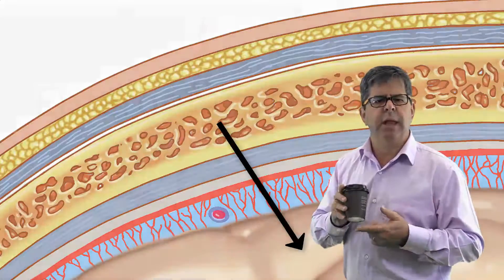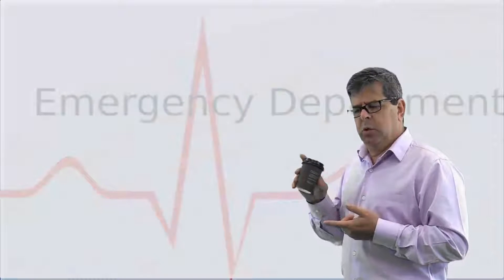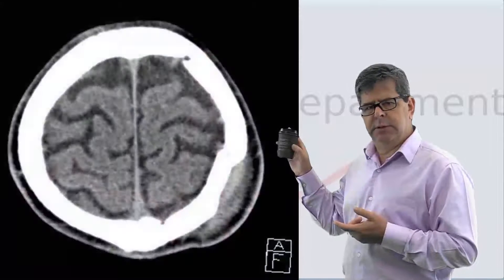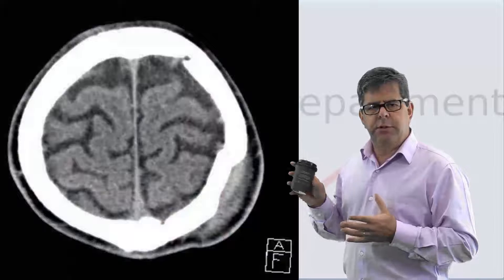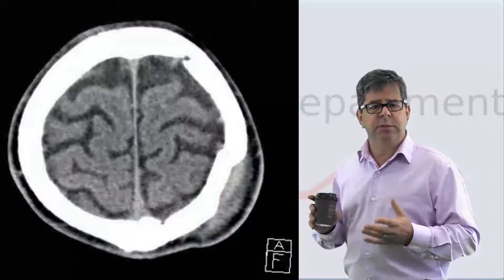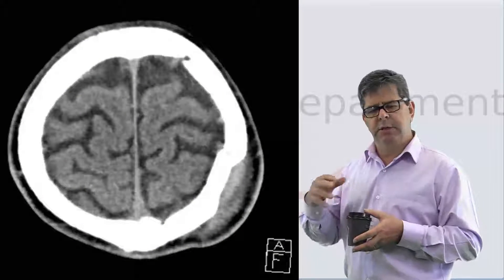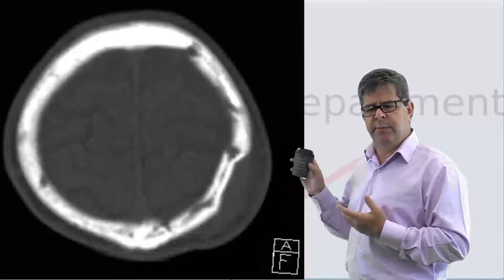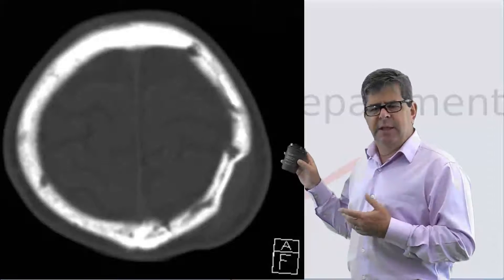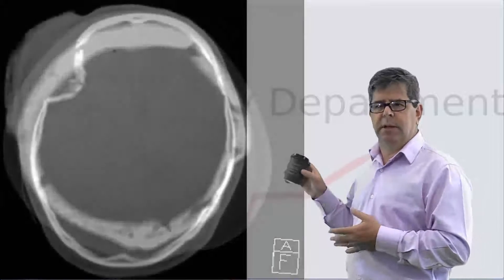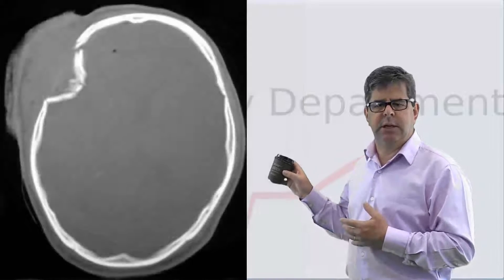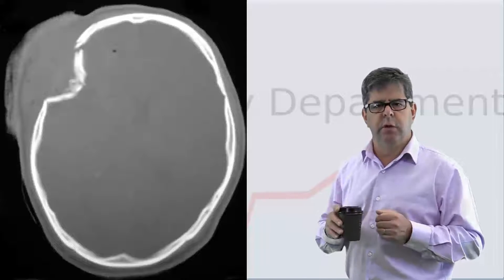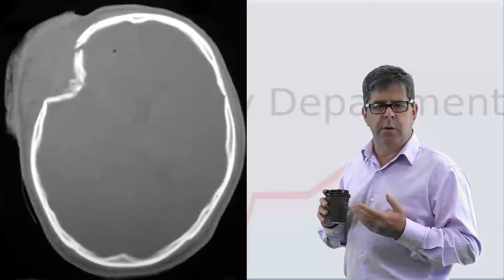Looking at skull fractures, it's very important to know that sometimes skull fractures can be missed if you don't change the window to a bony window. As you can see from this appearance, it's a little bit subtle. Sometimes, like here, it's not subtle, but it is easier to make sure that you look at it on a bony window.